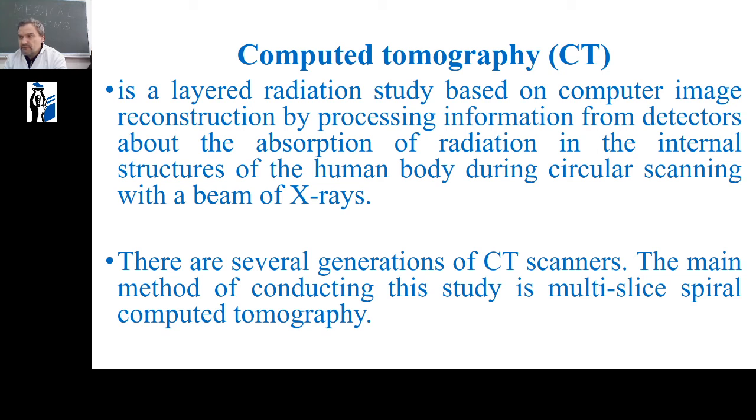What are the fundamental points of the definition? Firstly, it is a reconstruction, and secondly, it is no longer a film, but a set of discrete detectors located on the tube.